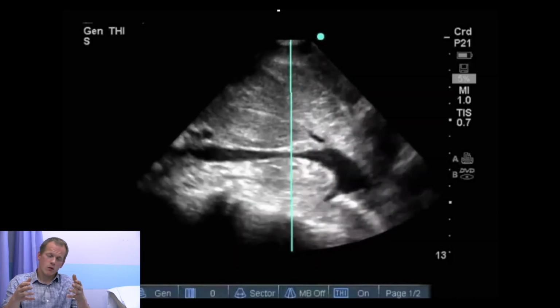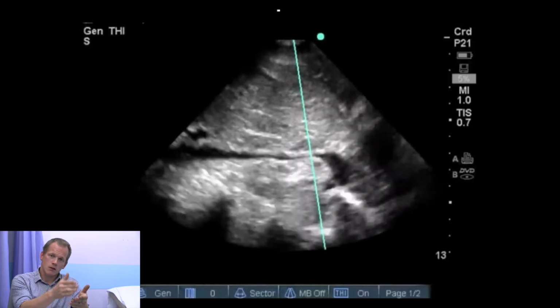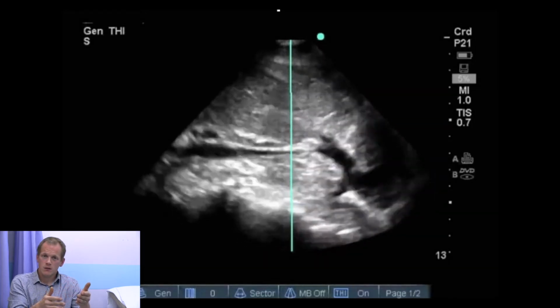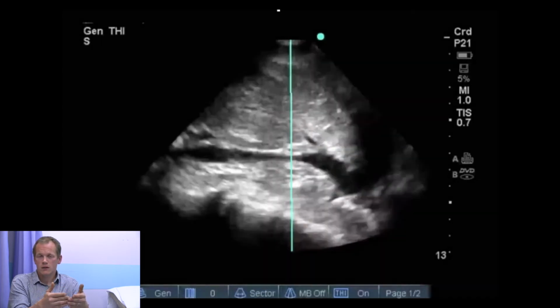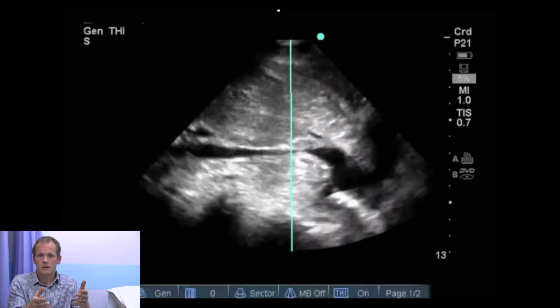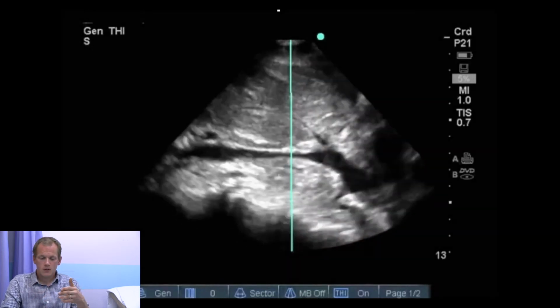But what I would say you could do from that is, on the same ventilatory pressures, you could do an assessment of the IVC, make some measurements. You could give a bolus of fluid if you thought they're hypovolemic, and you can make some more measurements, and you could see if their IVC is compliant and if they tolerated the fluid bolus from that.